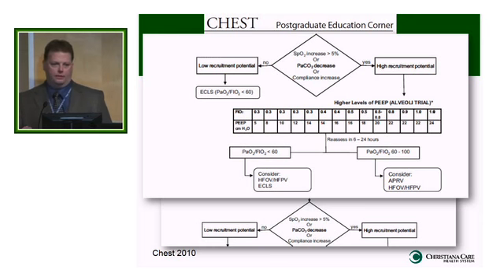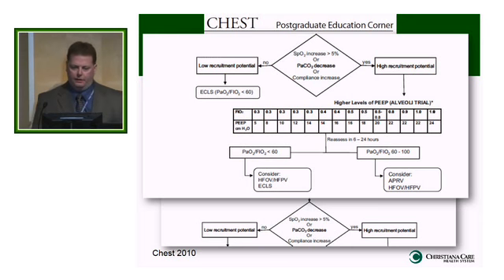So the point in showing this is that if you don't at your institution have buy-in with how you strategize for these patients, you should. Now, some of the things that we're going to go through next may be part of that strategy. So you should probably start with ARDSNet if you're volume ventilating places. You start with ARDSNet, but then you probably have to march the patient along as they progress and they show themselves to be an extremely sick patient.